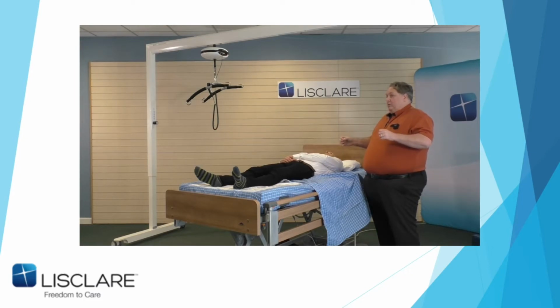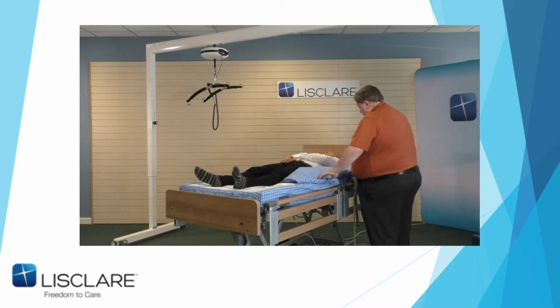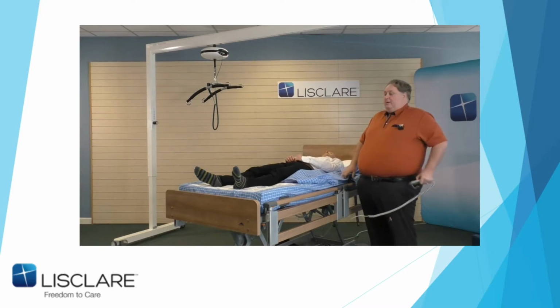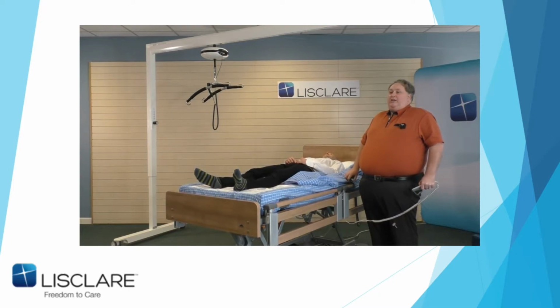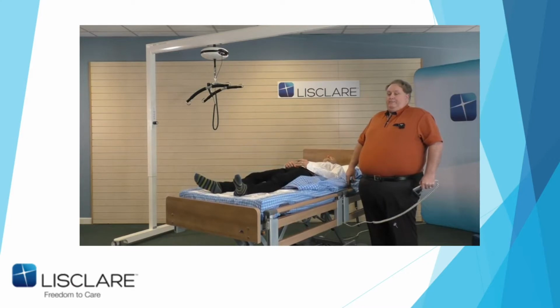Now, we've gone through how to do different things with a patient that's positive active, that's negative active up the bed. Now I'm going to do passive, and this is where poor John now gets involved in the lift. So I'll lower him down, and to show you how this can be worked, and John might not get stage fright just yet, this is his second webinar, he's going to move me up the bed.